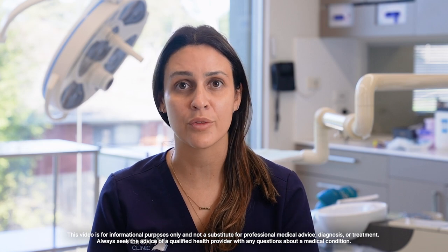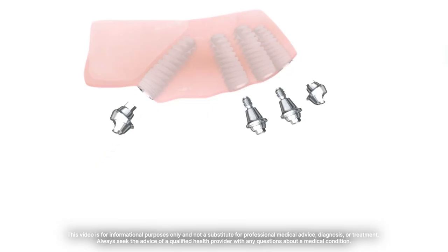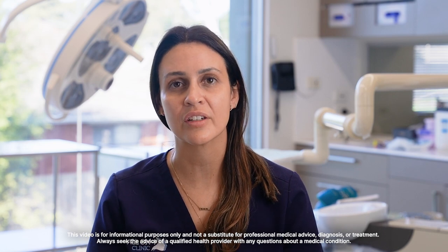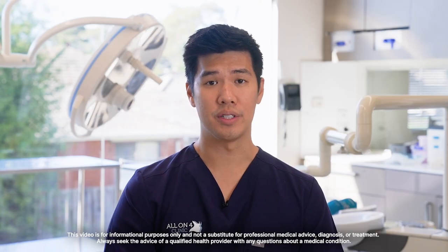Often when patients are asked about problems related with All-on-4, they're actually referring to the teeth themselves rather than the implants. It's very rare to have problems around the implants, but when you do present problems with teeth they're normally very simple to fix and repair. The teeth themselves can be replaced every few years to get a new set.